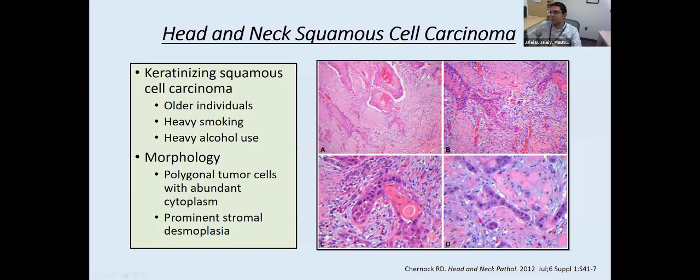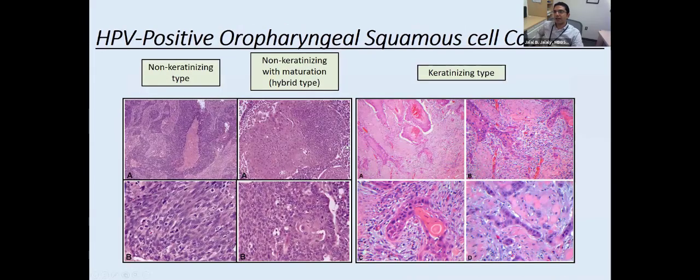On the other hand, the HPV-related squamous cell carcinoma, which most frequently affects the oropharynx, appears different. It's usually of the non-keratinizing type, and you can see here that these tumors frequently have abundant mitotic activity and apoptotic debris. They frequently have areas of necrosis, and usually they don't have really nice distinct cell borders, as you can see here in the keratinizing type. They usually have a syncytial growth, and the cells have a spindly or oval shape-like appearance, unlike the typical keratinizing squamous cell carcinoma.